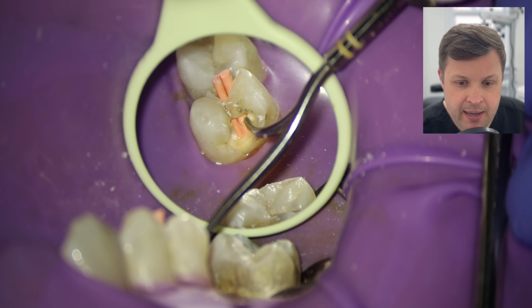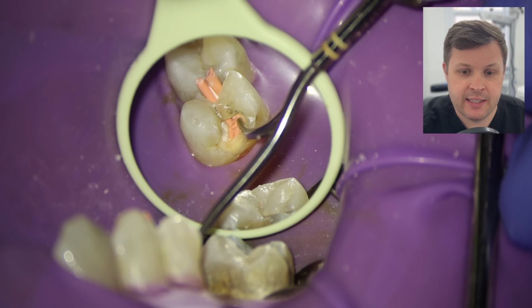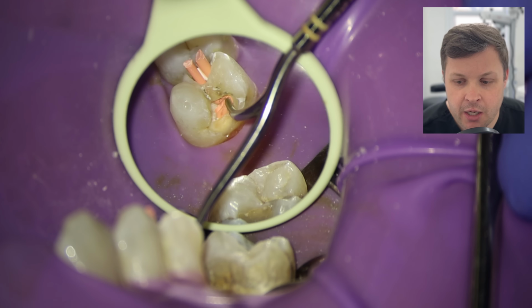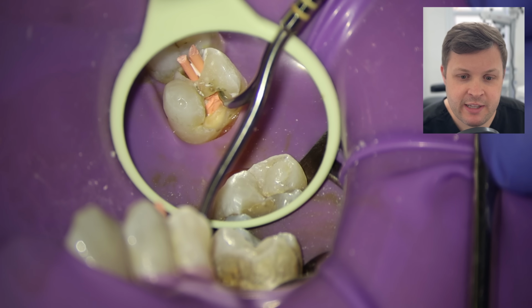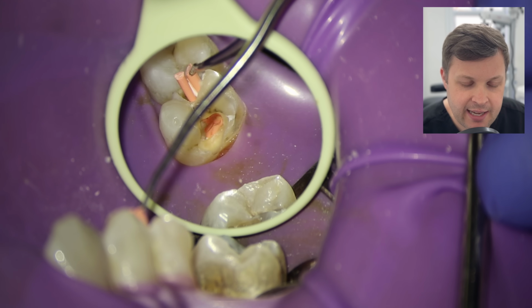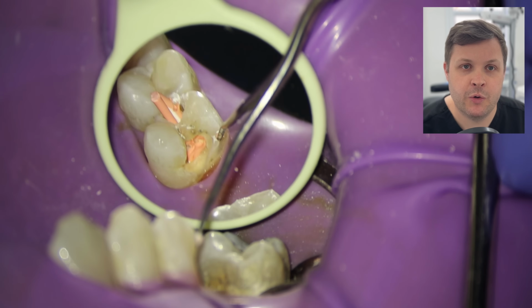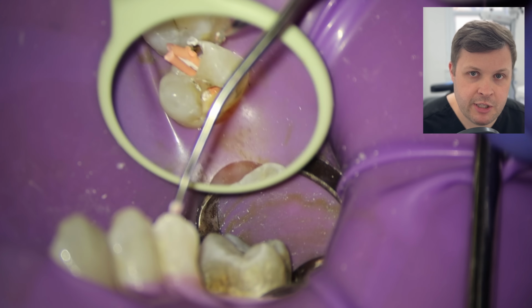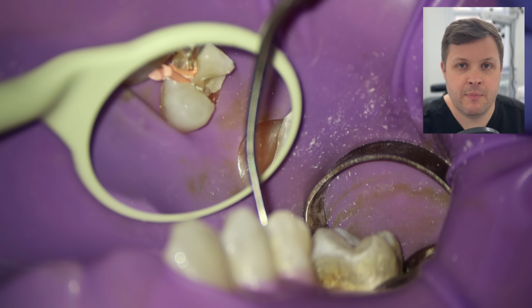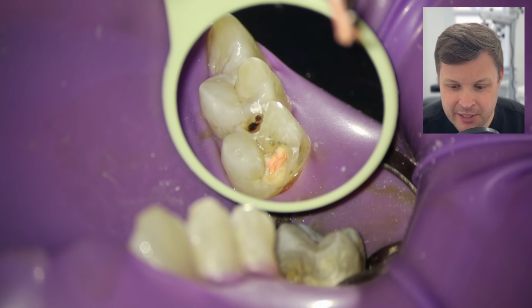And the great thing about, rather than cutting the GP cones downwards or vertically, if you cut them across, you're less likely to pull out the GP cones once you're removing the excess. And of course, if you pull out a GP cone, it's a bit of a risky business. Do you just push it back in? Do you reshape? Do you retake it? So it's all difficult. The best thing to do is the safest option, and that's just to shear it off from underneath the bridge.